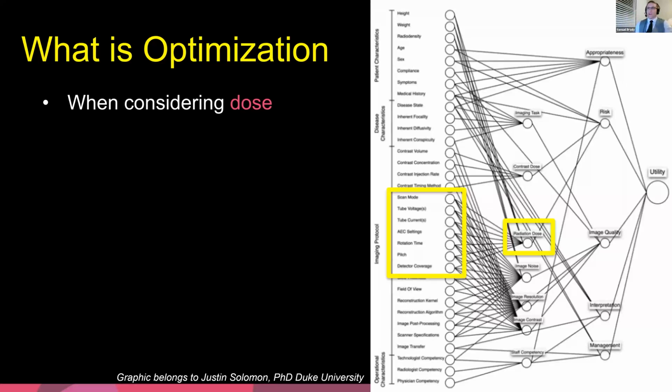So, water or fluid based. And so it doesn't actually usually require as much radiation. Typically, when we're doing face, just because when you look at the profile of the face, your face profile changes a lot more than your skull. And so using tube current modulation is great. But if you can, doing a single spin across your face, if you have the 160 millimeter scanner, that's appropriate too.